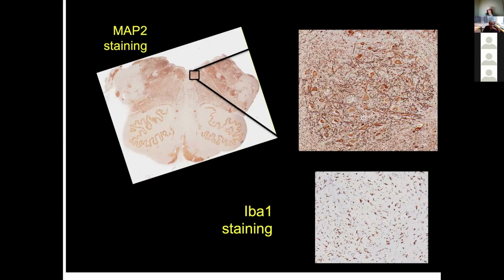And this is just a snapshot of what we're doing right now. This is from a patient, and we're starting to look at these different areas that are important for breathing: the hypoglossus, and over here, the nucleus ambiguus and the Pre-Bötzinger complex. We're looking at microglia, and hopefully we will get an understanding of what is associated with sudden death in these people.